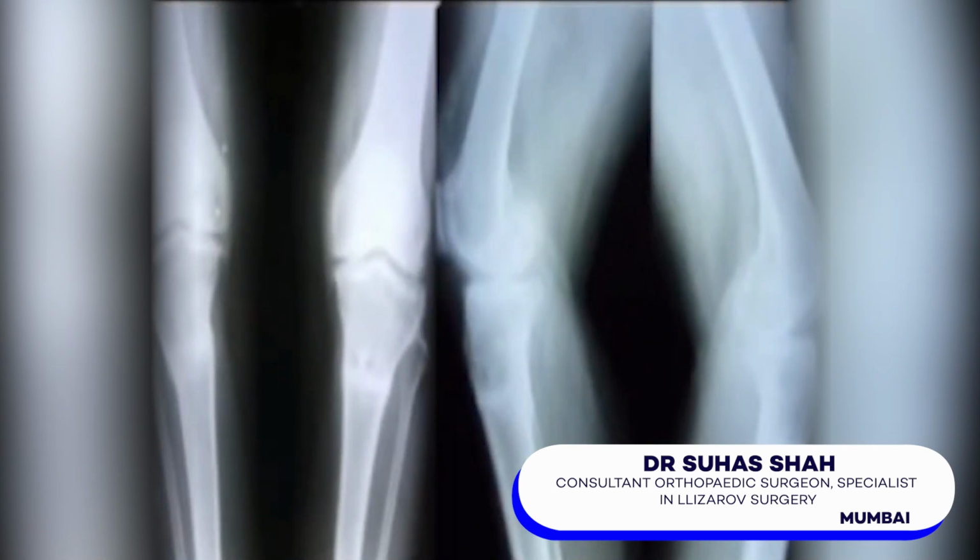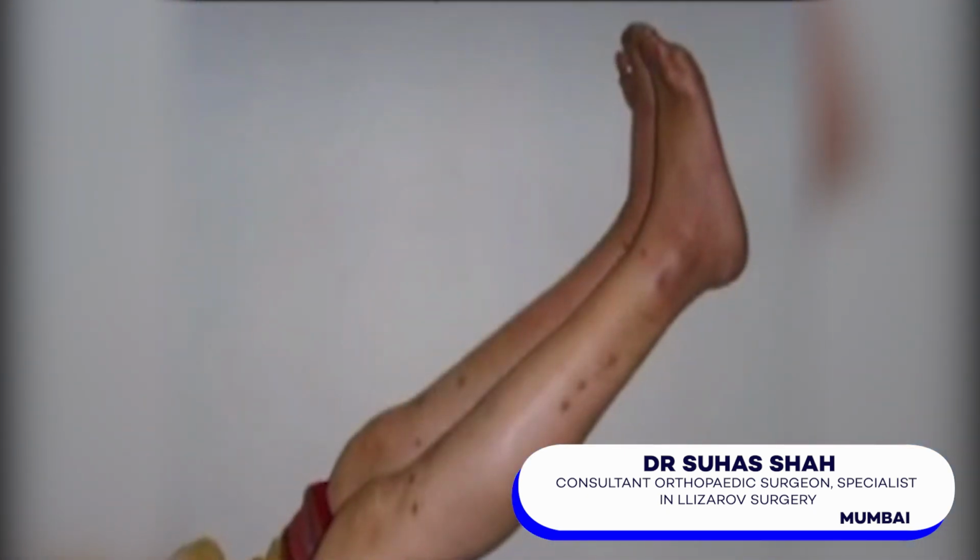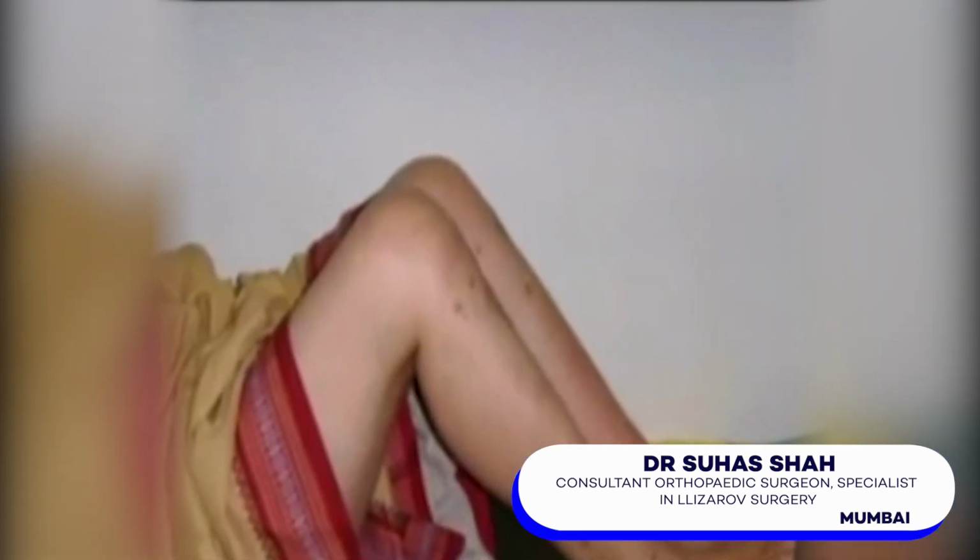After correction of the deformity, you can see in the X-ray that the deformity is completely corrected. After removal of the frame, you can see her deformity has completely disappeared. The movements of the knee joint can be achieved completely, and the patient can sit and squat after the treatment with Ilizarov fixator. The pre-operation video shows a lurch, and the post-operative video shows there is no deformity, there is no lurch, and the patient is walking much better than before surgery.